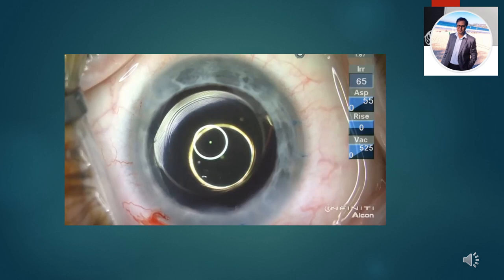And as you make the pupil meiotic, if you could make it on the table itself with pilocarpine, you should be able to see through the constricted pupil those two reflexes of the light from the cornea and the lens going through the bullseye, and you know that you have a perfect centration in the eye.